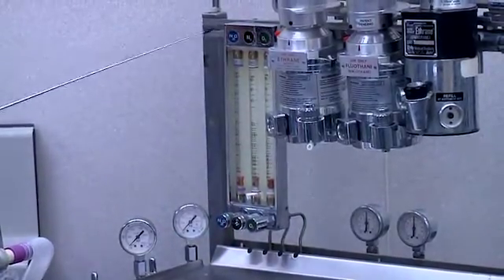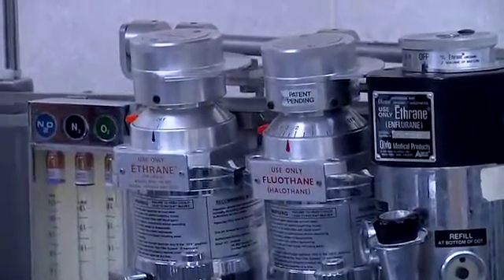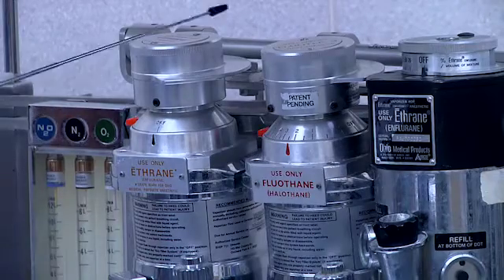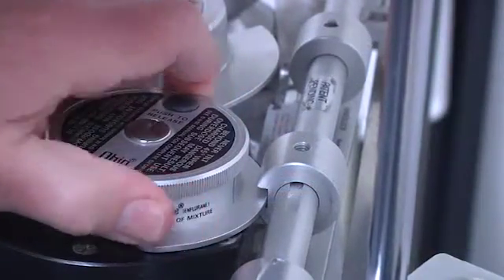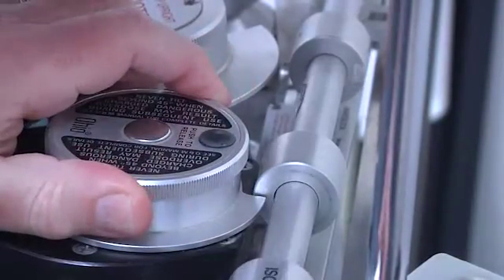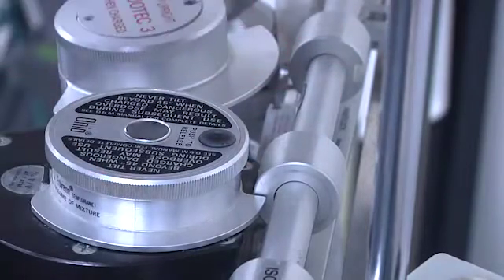This machine did not come with any sort of vaporizer interlock. This interlock and this bar in the back were added after the machine was in use. The interlock prevents you from giving more than one anesthetic agent at a time. The slot in the locking mechanism allows one vaporizer to be turned on, and when another vaporizer is selected, the others are blocked by the physical presence of this stop mechanism.